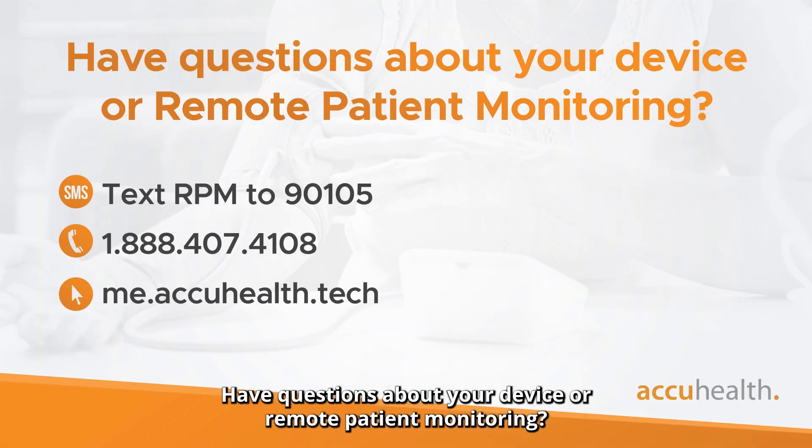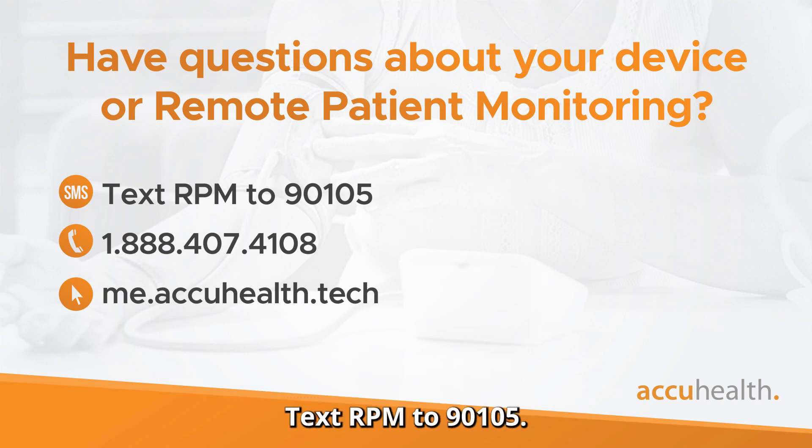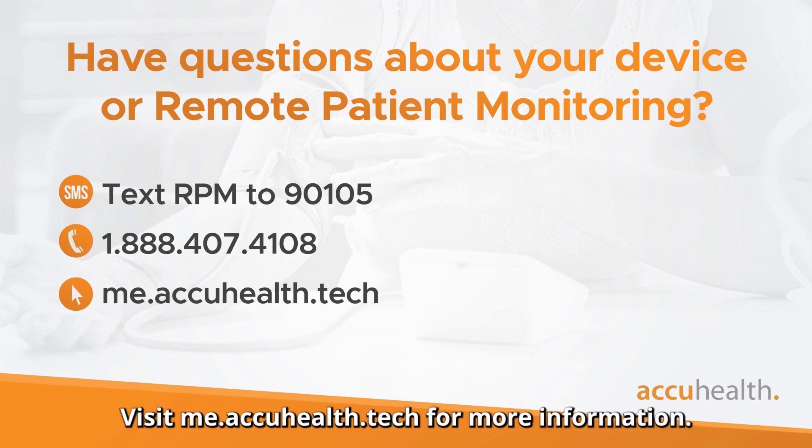Have questions about your device or remote patient monitoring? Text RPM to 90105. Call 1-888-407-4108. Visit me.accuhealth.tech for more information.